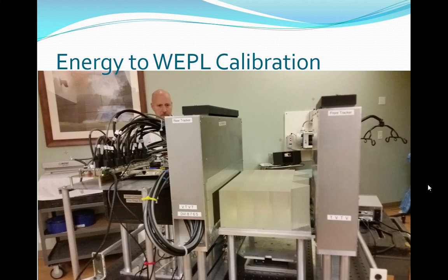So even though we're not as precise at certain points, the variance in between those steps was huge. So precision with high error caused these little faint banded rings of error to come in. Whereas when we had a continuous distribution, it may not have been as close, but it was consistent. So you didn't get this kind of clumping, which caused banded error rings.